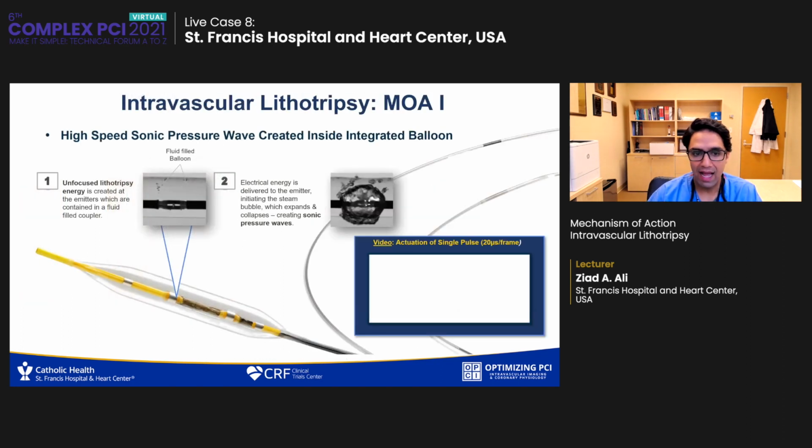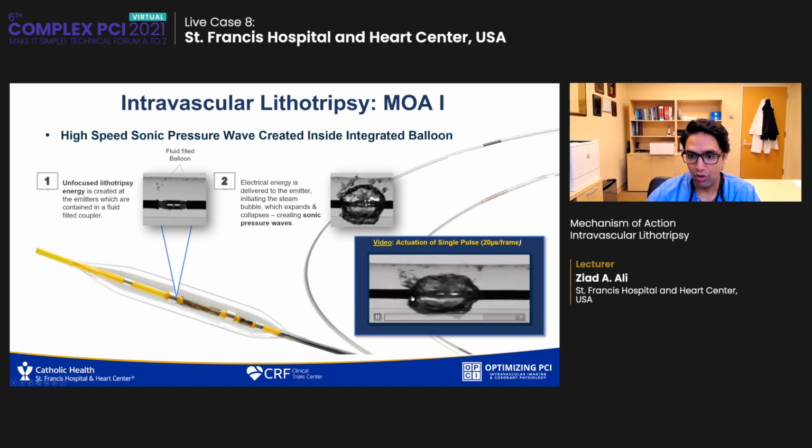So this is actually how it works. You have unfocused lithotripsy energy. This is the light bulb turning on. The energy is emitted. It creates a steam bubble. And as the steam bubble collapses, it creates a large acoustic pulse. And that's the energy that's delivered into the artery.